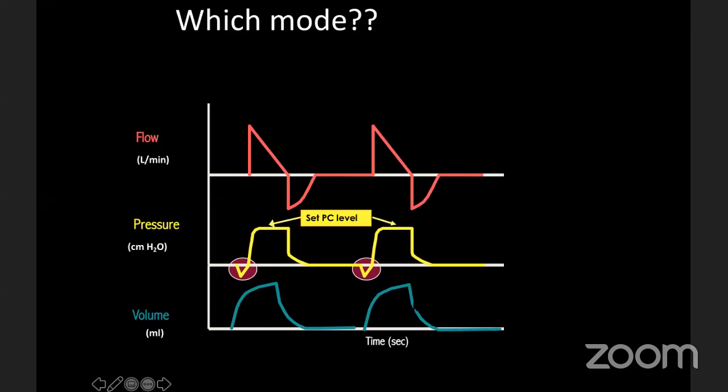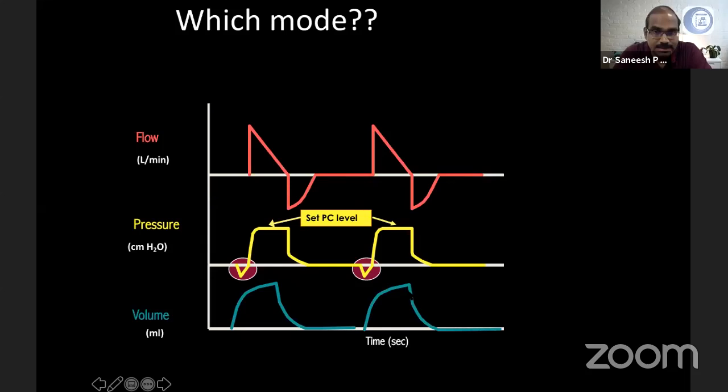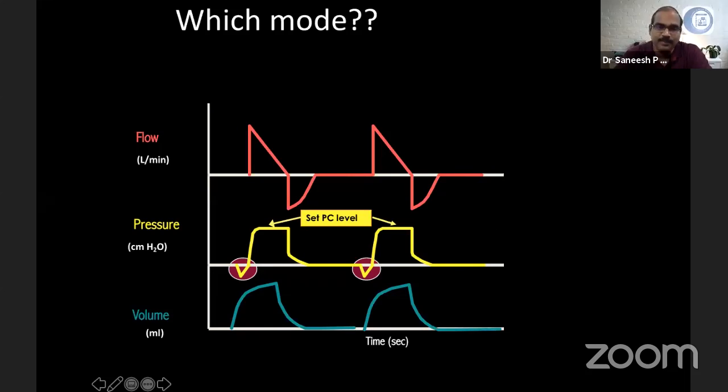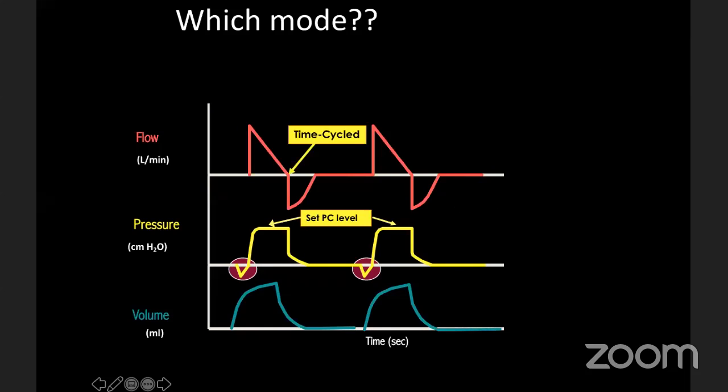If it is not touching the baseline, then there is some air trapping. There is leak. No, I am speaking about the volume. Inspiratory volume is given and the curve is switching back to the baseline. No. So there can be a leak. There can be an air leak. Okay. So all this information you can pick from the screen. Can be an air leak or an air trapping, sir.